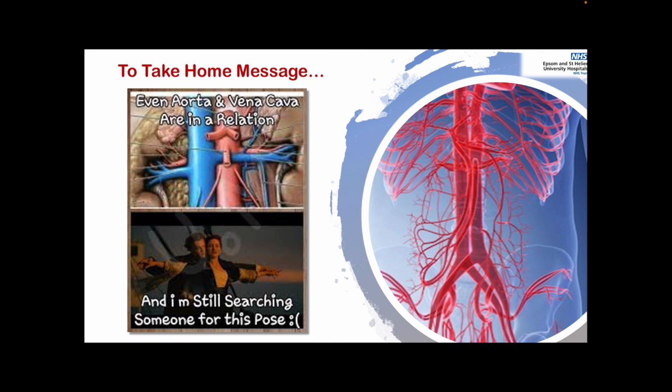Focus depth of 10 centimeters is enough, and image depth of 15 centimeters will be enough. Be careful when measuring the diameter of the abdominal aorta. Include the thrombus if there is any thrombus. Save the images. We need them. You will not rule out triple A unless you can see the entire length of the aorta. So it's not enough to see, for example, the middle of the aorta while you are not able to see the epigastric or lower level. So see the entire length of the aorta.